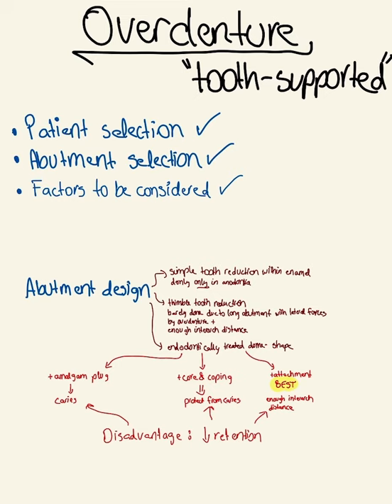Hello, today I'm going to explain to you the overdenture, especially the tooth-supported one. So, to begin with the overdenture on a patient, we have to do the patient selection first.